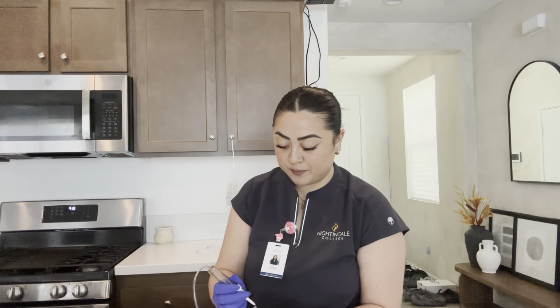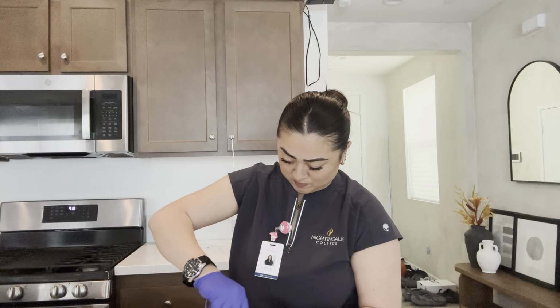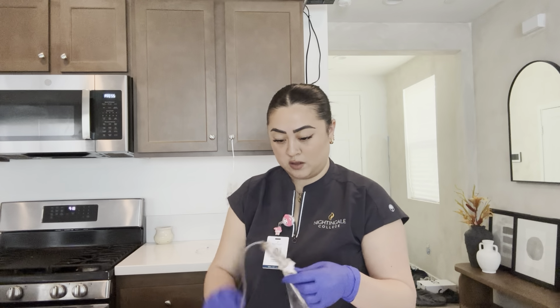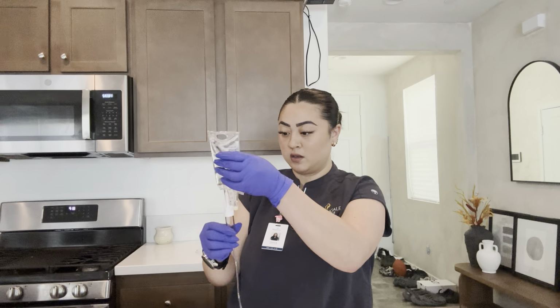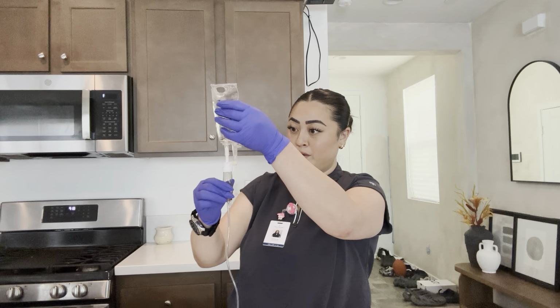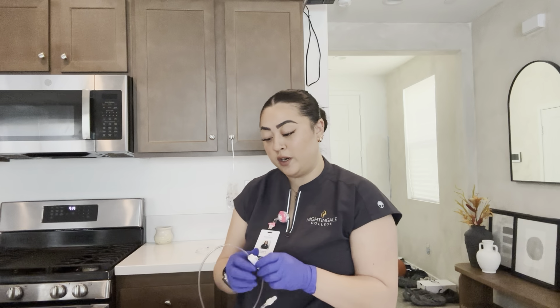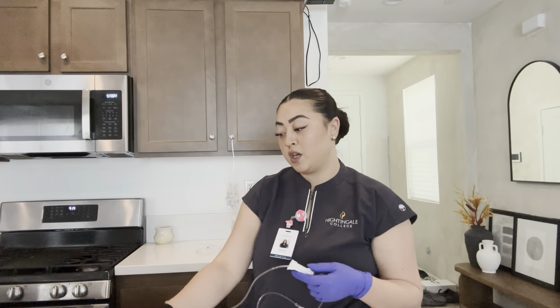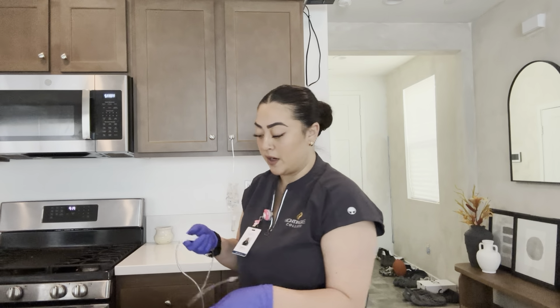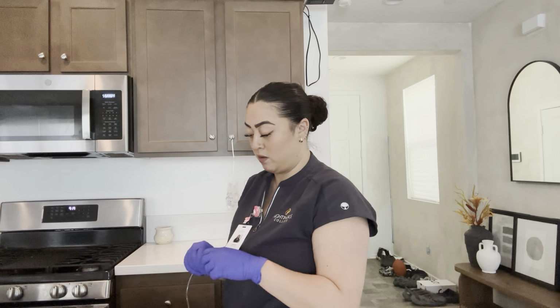So let me go ahead and remove this. Have my spike here. You just want to get about a quarter or halfway through. There we go. Really important when we're priming, we don't want to get rid of too much of this aspect because it's the medication. We want to ensure that the patient gets the right dose, but we do need to prime. Make sure that there's no air bubbles here.